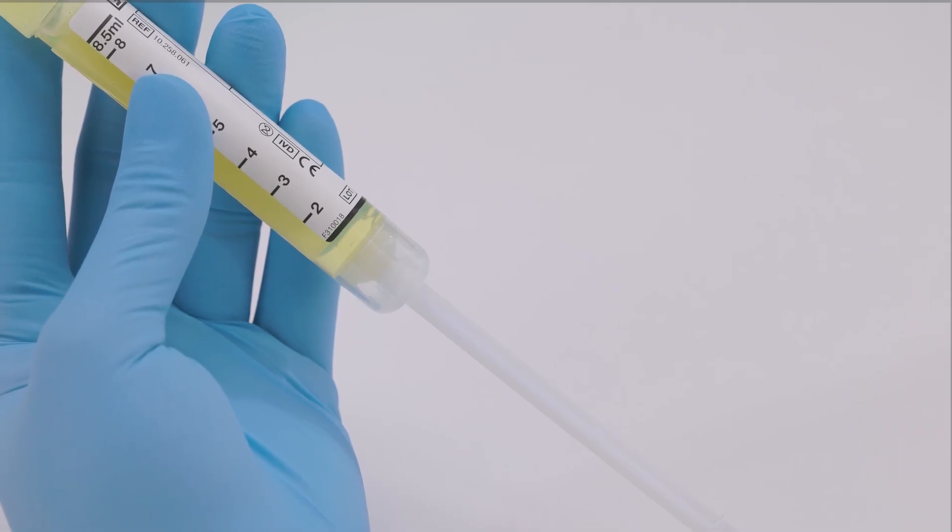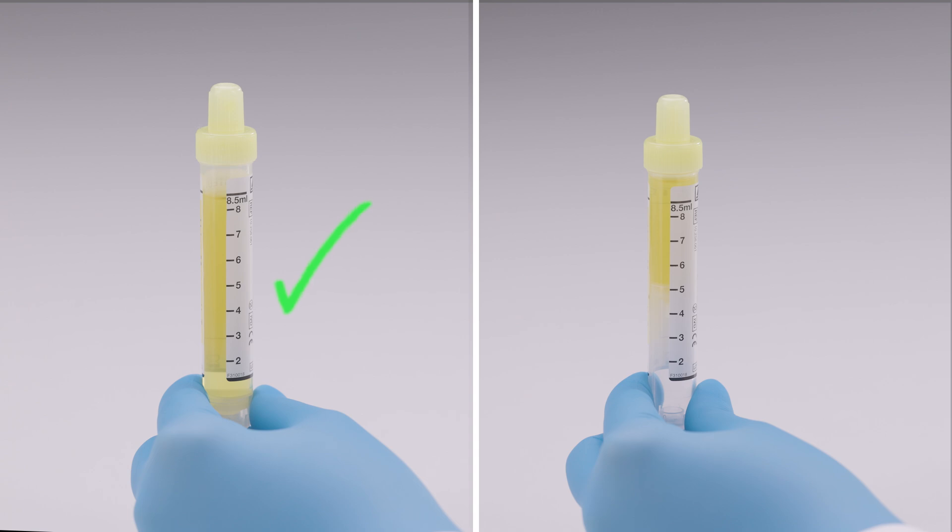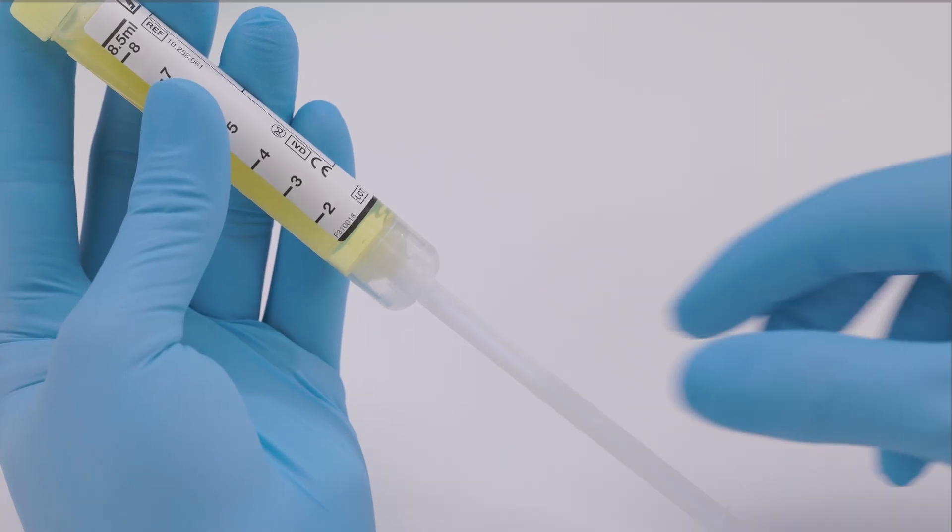Important: the piston rod needs to be pulled completely to the bottom of the tube during sample collection so that it breaks off easily. This also avoids insufficient urine volume in the tube. Break off the piston rod.